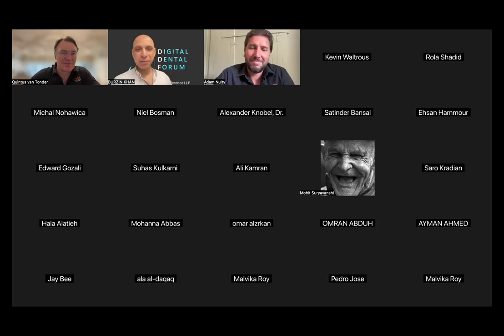Yeah, so we use it for our full mouth rehabilitation cases where we need to exactly analyze the final position and the condyle positions.